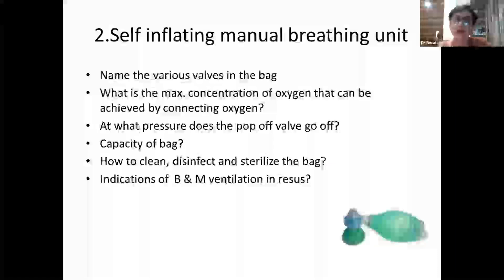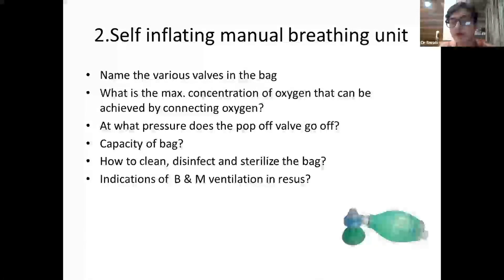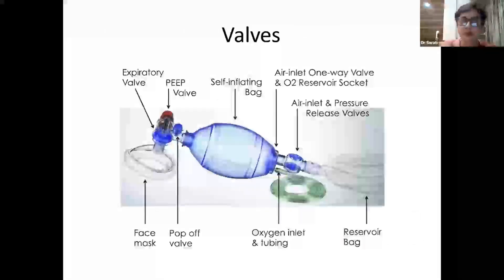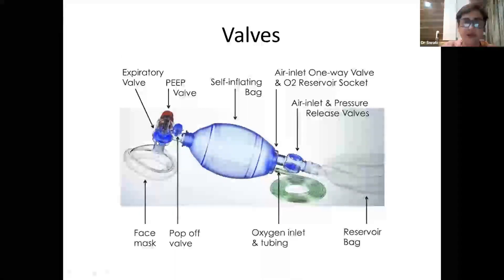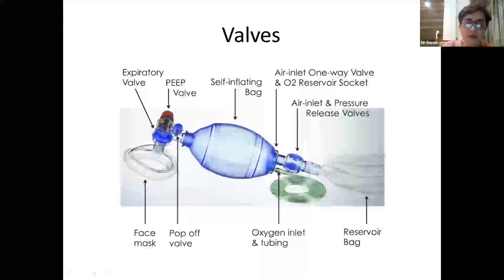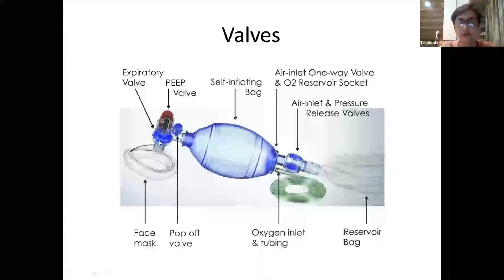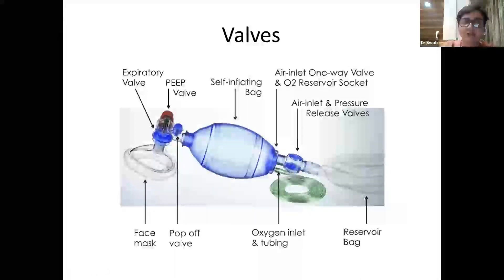The second piece of equipment is the ambu bag — a very basic device used in neonatology daily. Students are expected to know everything about it. There are several valves: starting with the expiratory valve, a circular valve near the end that connects to the mask or tube, which allows air to escape whenever the patient breathes out.